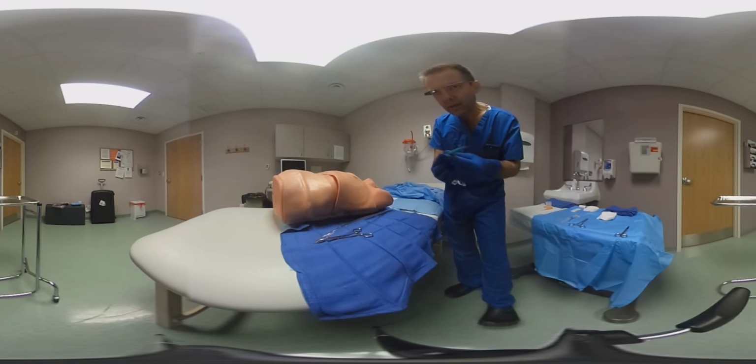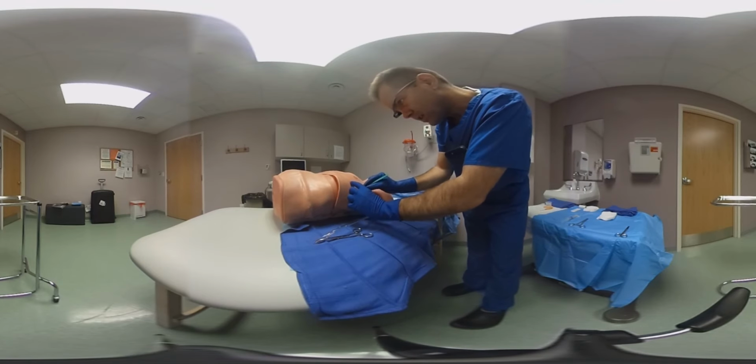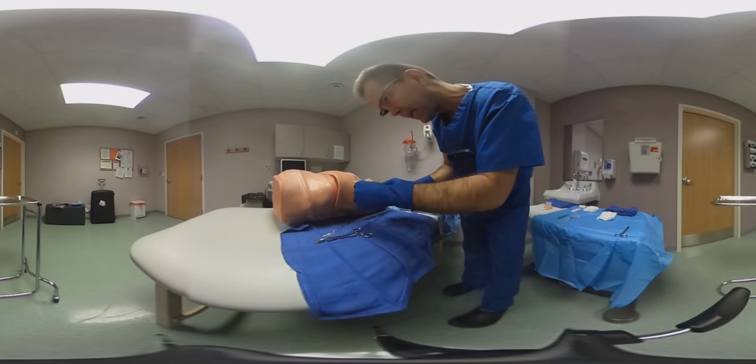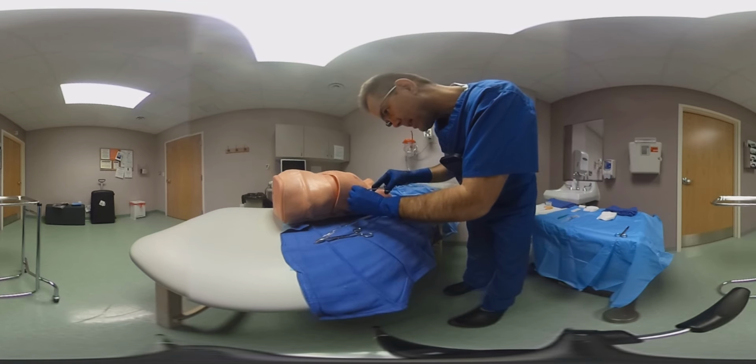So once you choose your site of insertion, you can make an incision, and once you make an incision, you use a curved Kelly clamp, again, to dissect the area, the subcutaneous area and the muscle, and find the top of that rib and push into the pleural cavity.